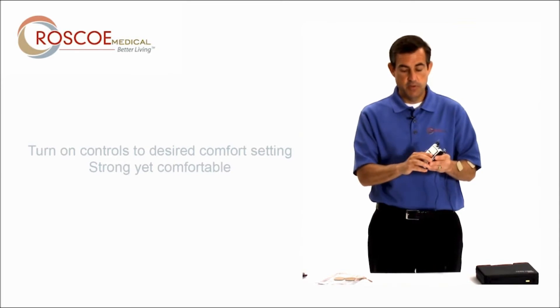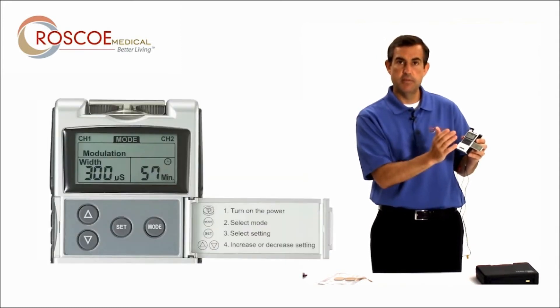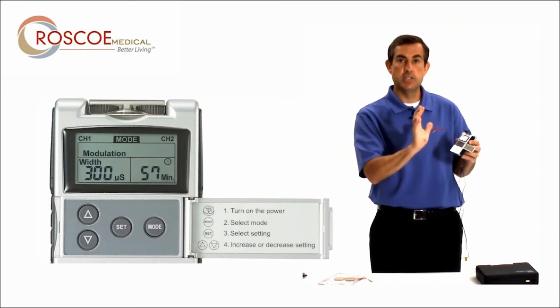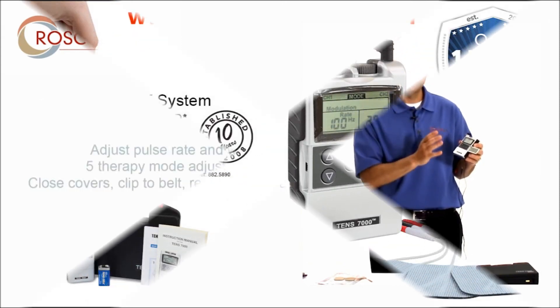If I want to change any of the settings, I simply open this little door. The set button is to change the timer — how long it's on — the pulse width and pulse rate. The mode button gets you into the programming to change the different programs available in this unit. There are a total of five programs, and that's so your body doesn't get used to the signal.